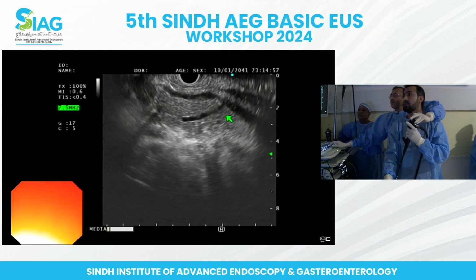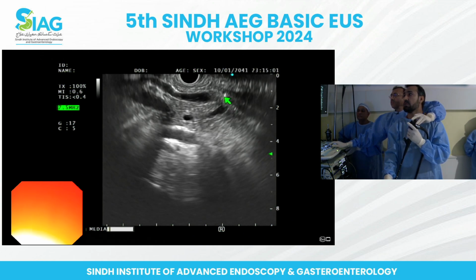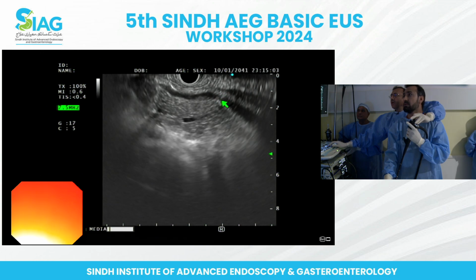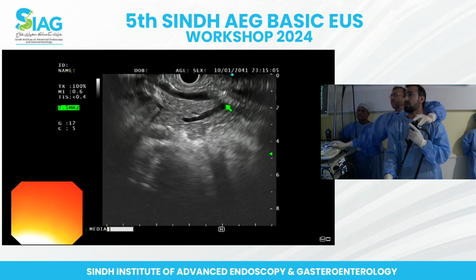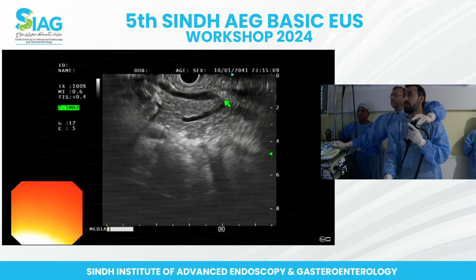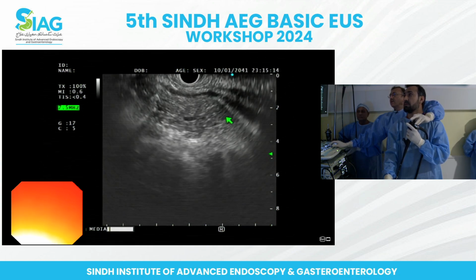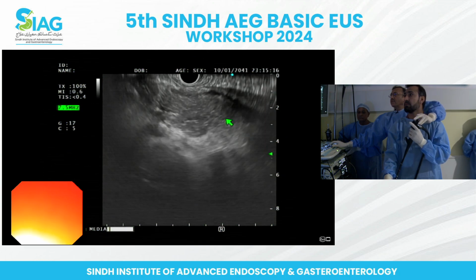Do you see anything hypoechoic? Yeah. Do you see anything hypoechoic? No, it's more of hyperechoic. So possibly it's some inflammatory area, not neoplastic, right? So slight right, left.